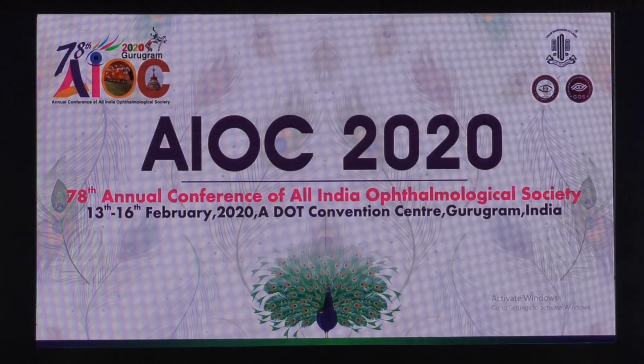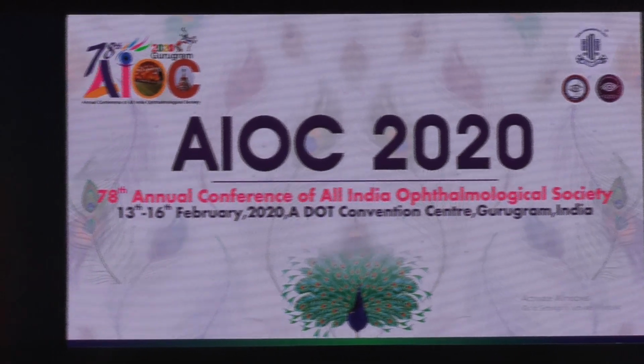My question to Dr. Reema. Ma'am, these days are you doing purely a vitrectomy for vitreous biopsy, or like earlier, when we used to do vitreous biopsies with a 26 gauge needle in the OPD or emergencies? Is that indicated anymore? No, I think, Pooja, in the era of microincision vitreous surgery, just vitreous aspiration is not recommended. We don't do it. We simply go for a good vitrectomy that helps for both diagnostic and therapeutic purposes. Just aspirating, I think, has more complications.